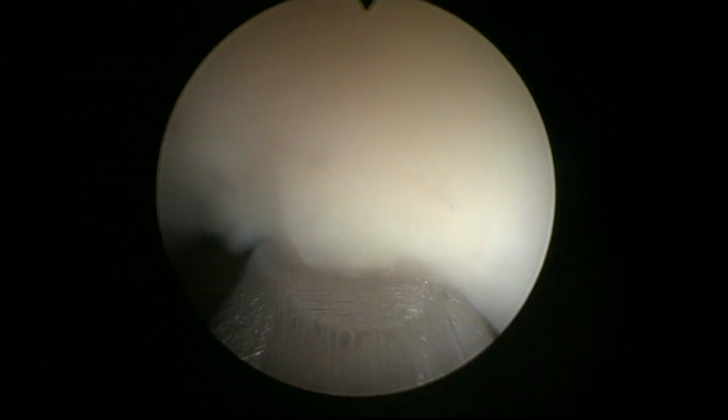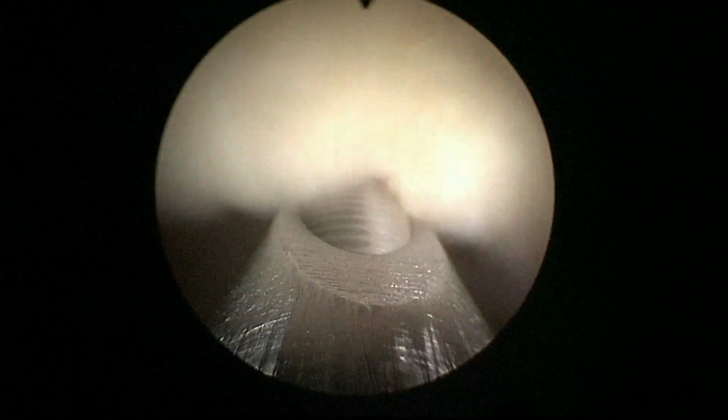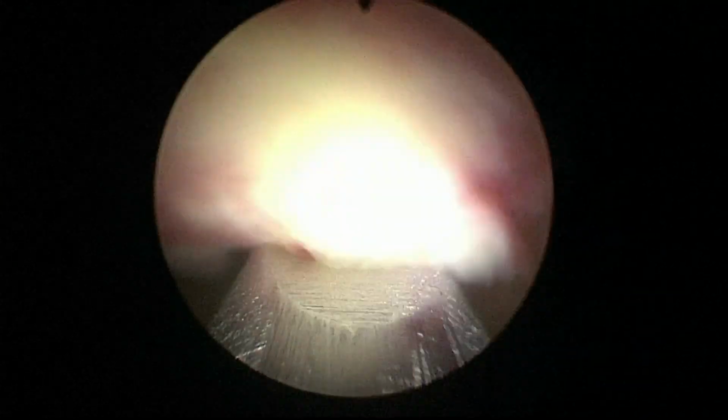I don't like very much when the tissue is so close to the camera that you don't have any perspective. You cannot see the little black triangles. But I was in a safe position, a little bit over the bladder neck and almost inside the fossa. So I kept the pedal down and tried to conclude. I could not see the opening of the bladder too much, and I trusted that the bladder would stay reasonably filled during the morsellation of these pieces. That's almost the end of morsellation.